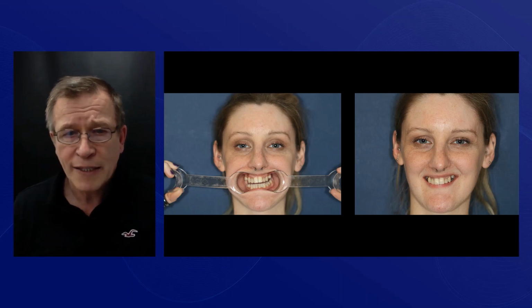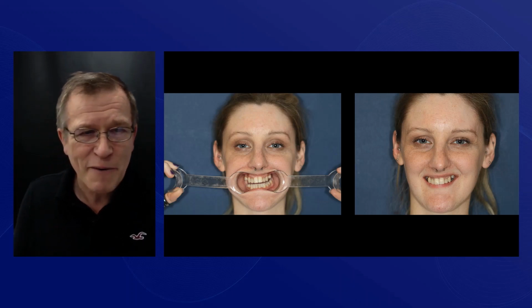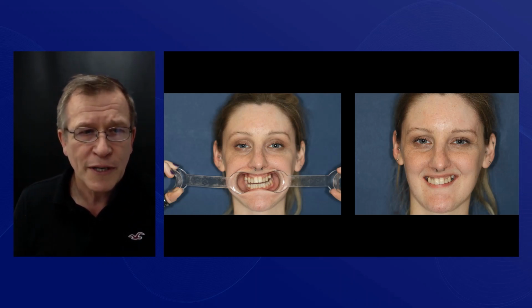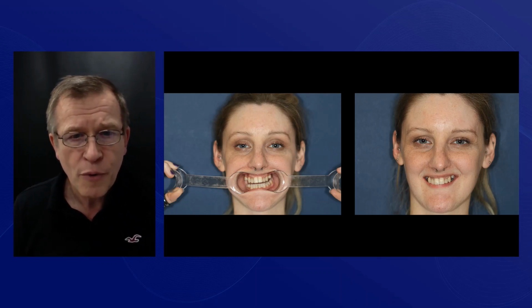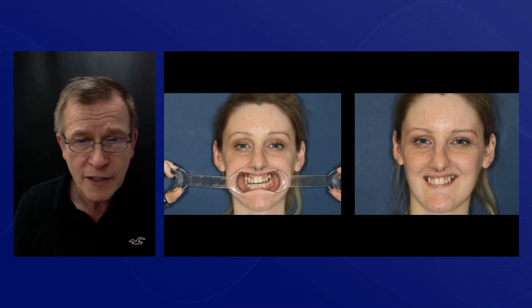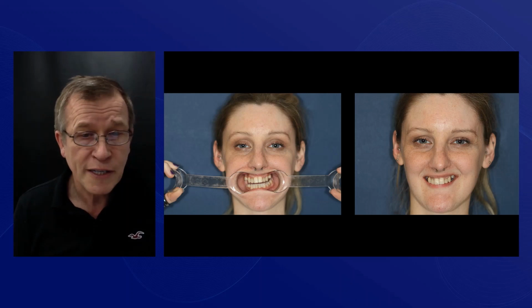Once we got through our planning, she promised me she was going to get rid of that ring if we did a nice job for her. But once we got through some initial preoperative ortho, we put some temporaries on to help the surgeon and the orthodontist understand where the teeth need to go. You'll notice that there's a cant there.